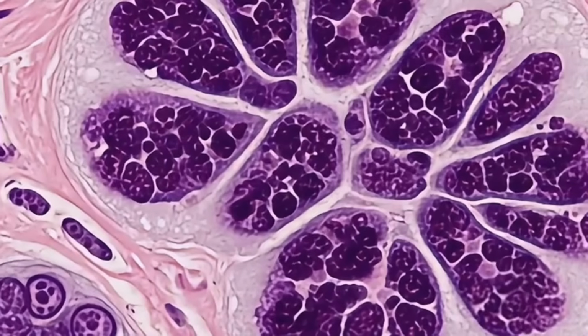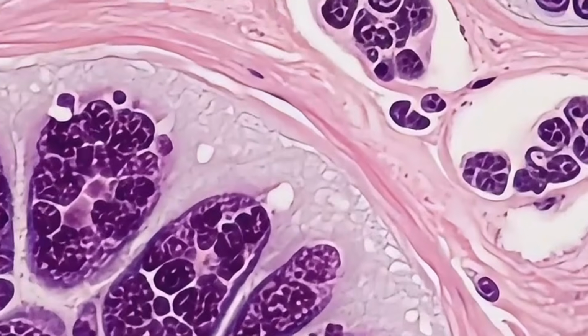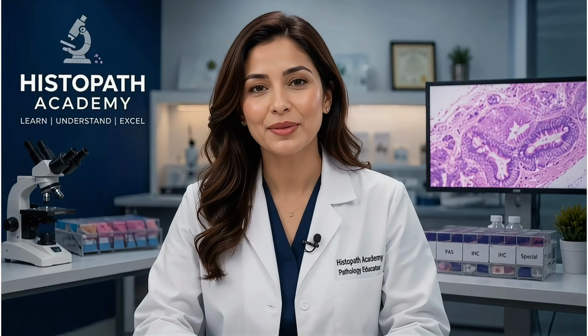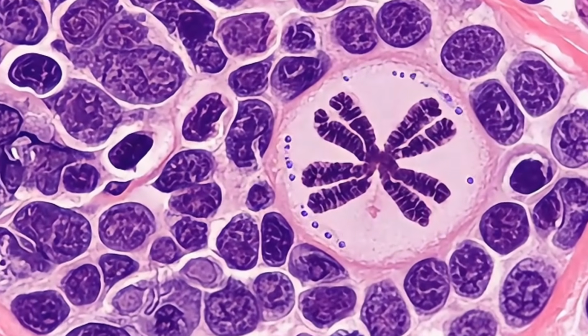You may also notice that the nuclei stain much darker than normal. This is called hyperchromasia, another classic feature of malignant cells. And if you're lucky enough to catch one, you might even see a cell in the middle of dividing. That is called a mitotic figure. It tells us that the tumor is actively growing.